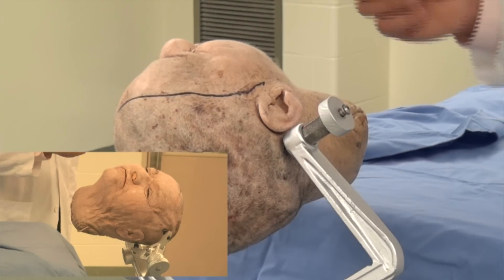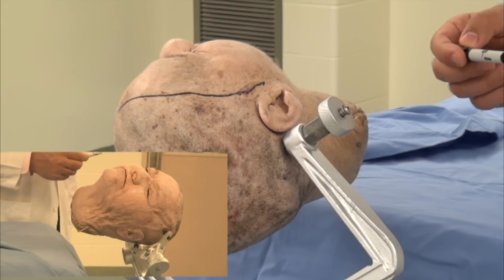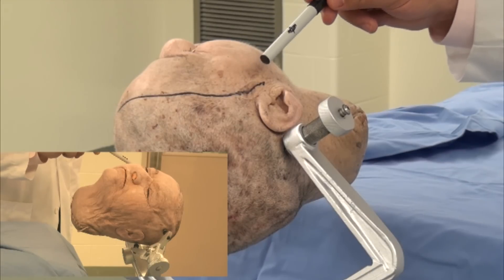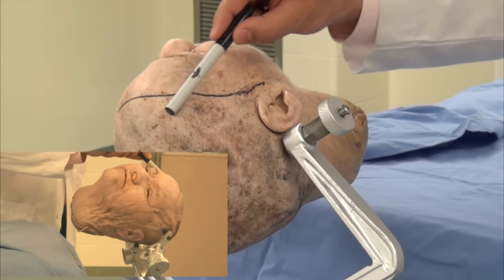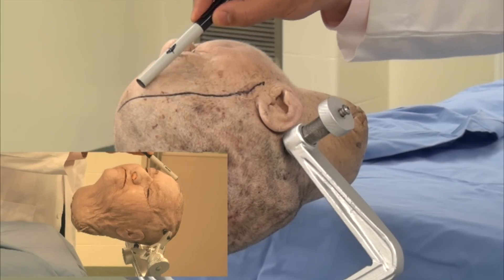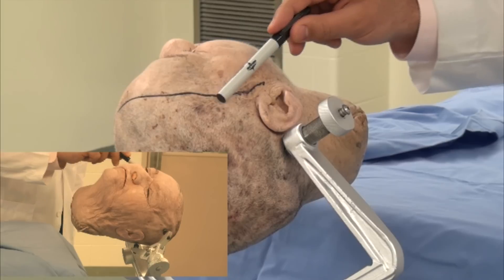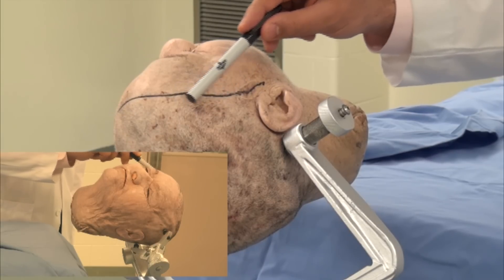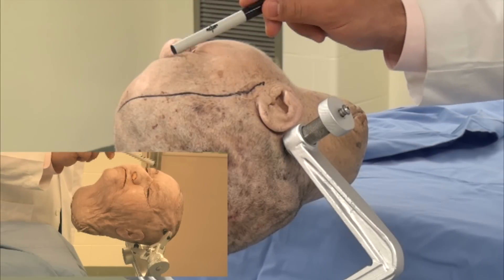This is one way of placing your incision for pterional craniotomy, which is our preferred approach. However, some surgeons do extend their incision and make it more curvilinear, just slightly into the forehead. That usually causes more scalp to be included in your incision as you reflect it.